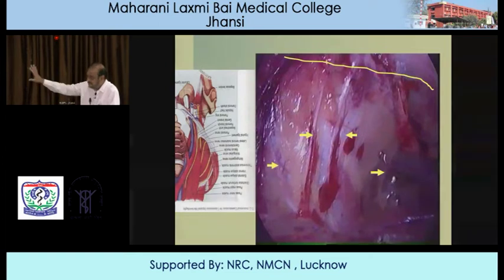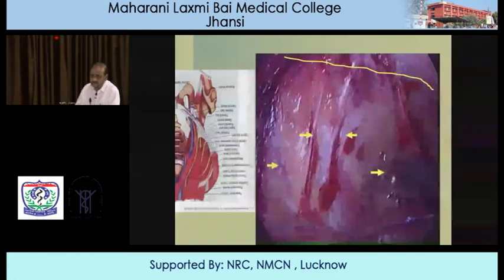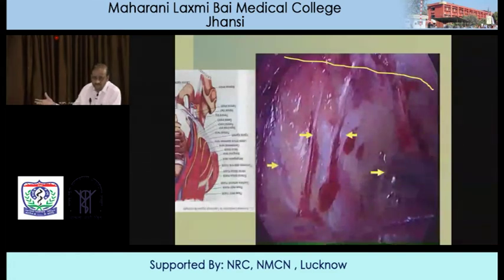So never try to see these nerves. Look, I'll try to demonstrate these nerves, I'll push the fascia off and try to demonstrate them. What's going to happen in this patient? Post-operative neuralgia. So don't do it. Try not to breach the psoas fascia. Don't do it. Right? And that's why they're important.